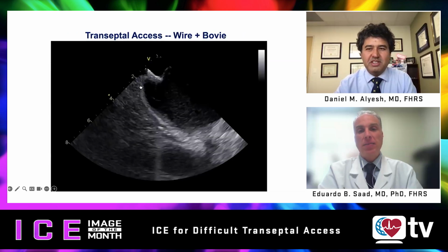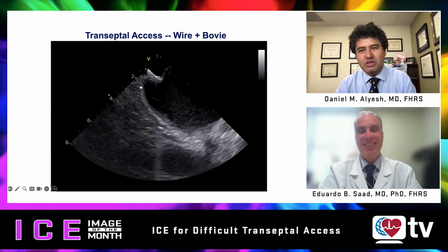So I love this technique. It's the poor man's RF wire. I use it all the time. A beautiful example. I'll let you talk through this technique and when you choose to use it.